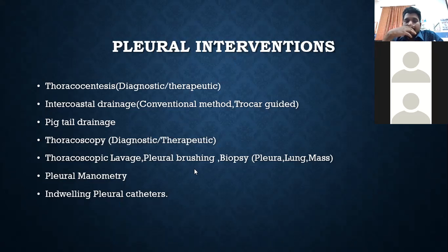So like lavage, as I already told, we have a concept of brushing also, which is another quite good concept. The same way what we use in bronchoscopy, like bronchial brushing, there's a specialized brush. Through bronchoscopy, we use the brush and scratch over the area where we want a good yield. That will give additional exfoliative cytology results, which is very helpful in arriving at a diagnosis.